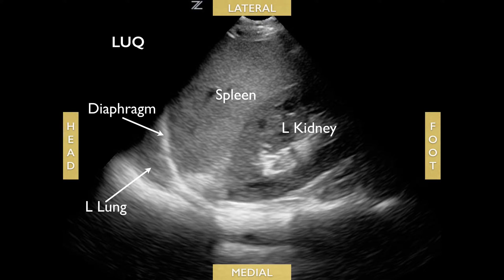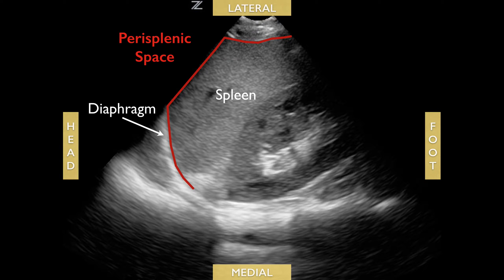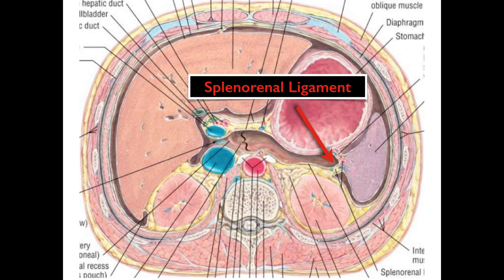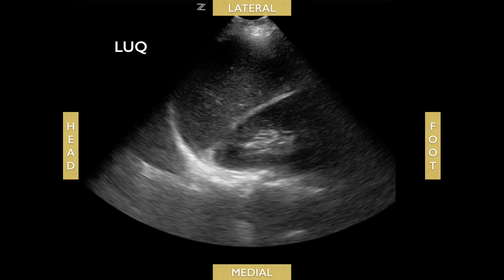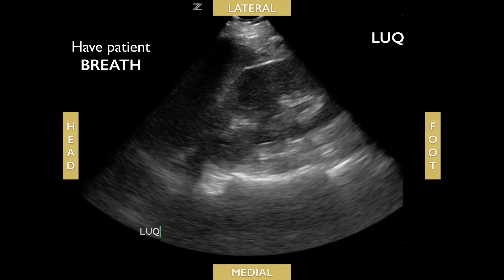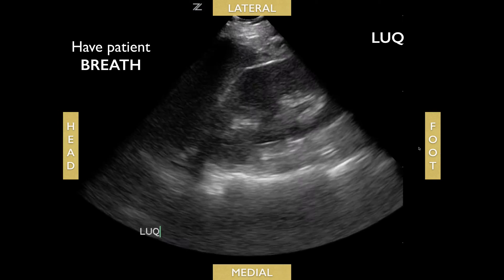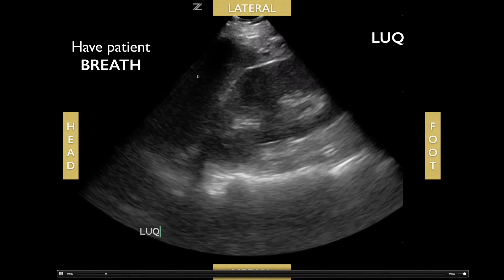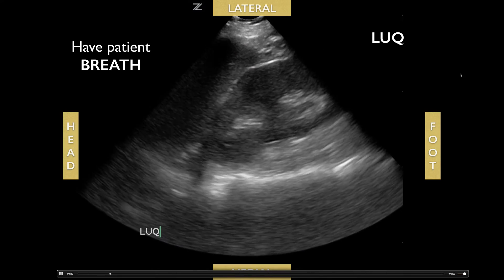For the left upper quadrant view, similar to the liver view, you'll see the left lung superiorly, then the diaphragm, then the spleen, and then the left kidney. Importantly, fluid tracks around the perisplenic space and not between the spleen and kidney, because there's a splenorenal ligament between them. If you have rib obstruction, have the patient breathe in to improve the view.